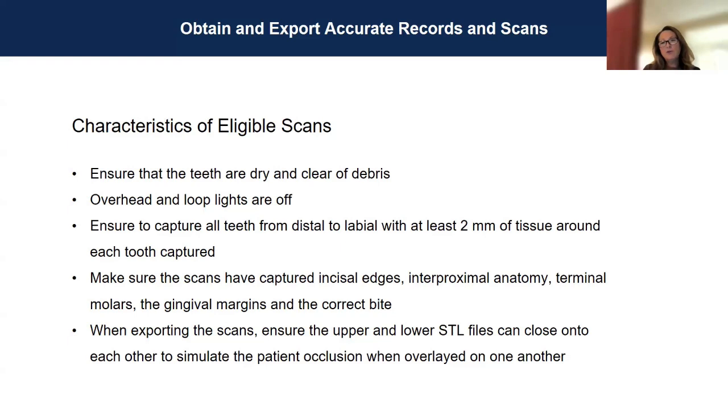And you can correct one arch, you can do a single arch case. Like the patient has beautiful, nice straight lowers, a couple rotations on their upper. We can treat one arch cases, but you still need upper, lower scan and the bite.